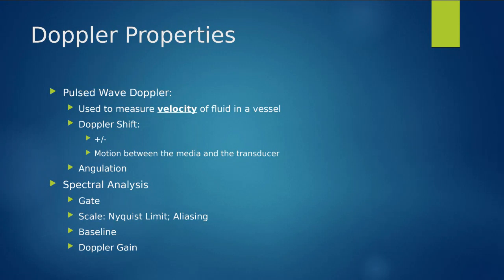That is a very basic way for us to put the Doppler shift of doing pulse wave Doppler. We will get more into that. So if it's not making too much sense to you right now, don't worry about it.